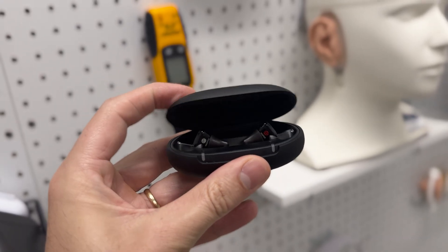Sony hearing aids are our best-selling and top-rated in-ear device at soundly.com. We've put this product in the hands of thousands of customers, and through that experience we've learned about some of the questions that folks ask about the app setup process. Hopefully by the end of this video, you'll have a good sense for how this app really works.